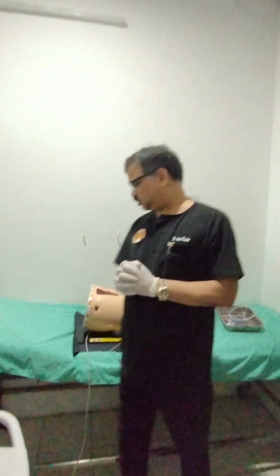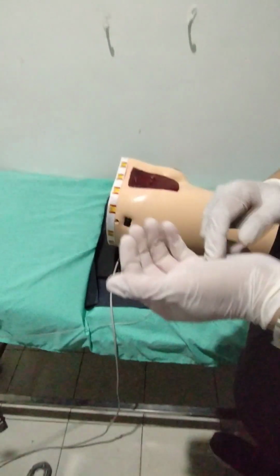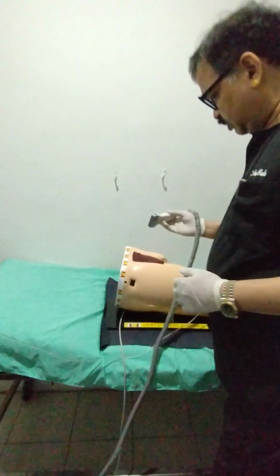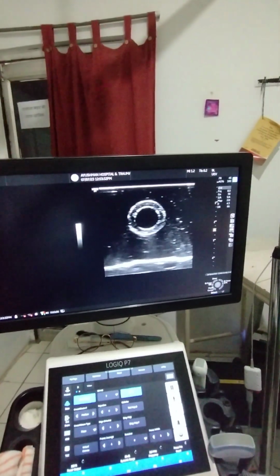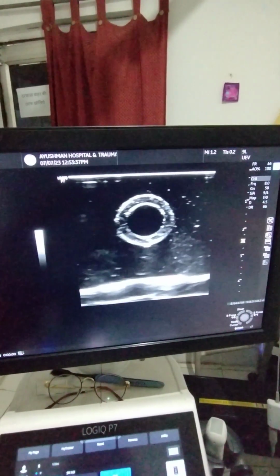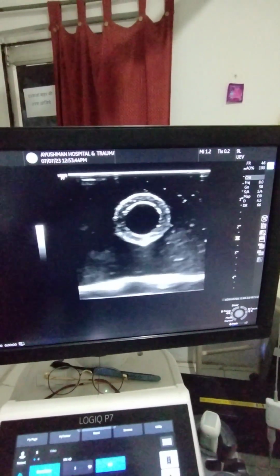Now coming to the mannequin, so this is our mannequin, and when you press this button, you will feel the femoral artery pulsation. But as I told you earlier, we are going to puncture this artery with ultrasound. So you need a linear probe, and when you keep it, this is what we have tried to focus on, the artery. We have not shown the vein. You just see it is pulsatile and has a slightly thicker wall. Now we will puncture it.